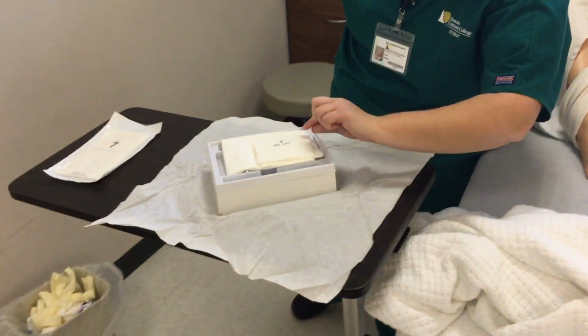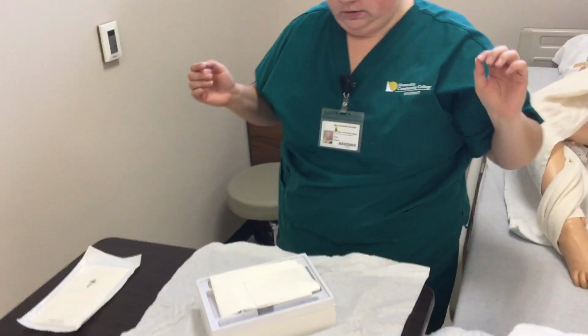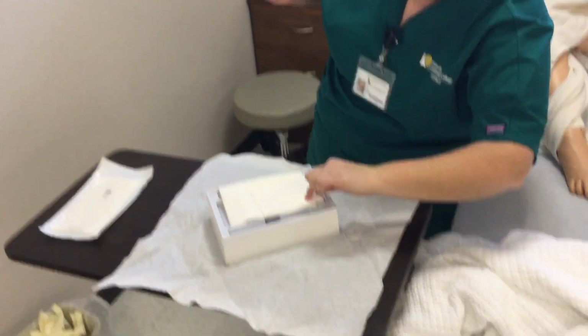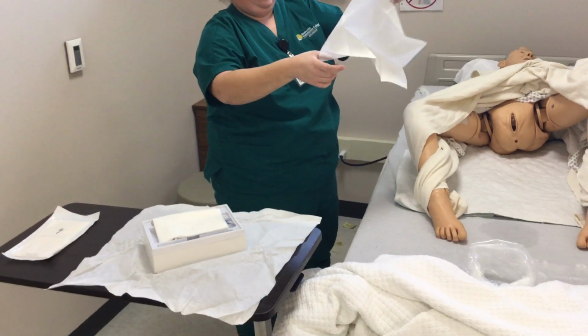Going to come in and get those out. Alright, so we're going to start with cleaning the back. And out. There's the clean down.